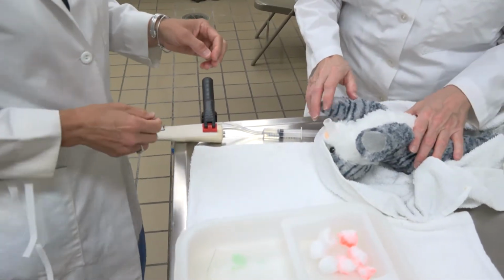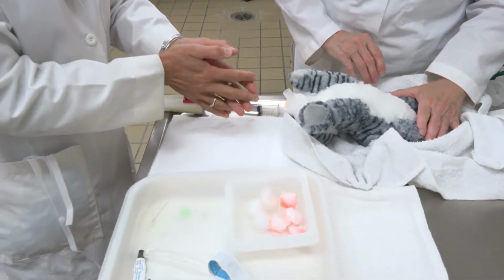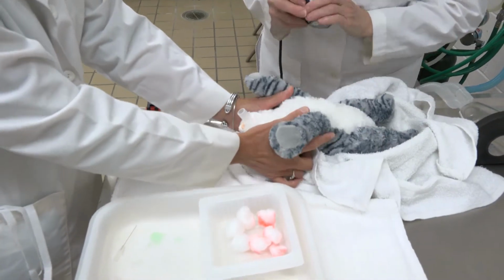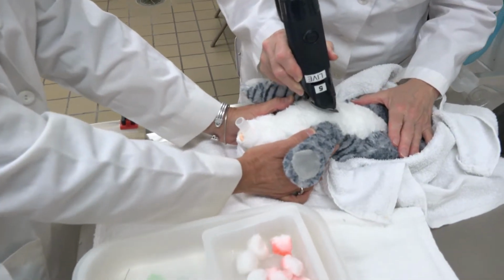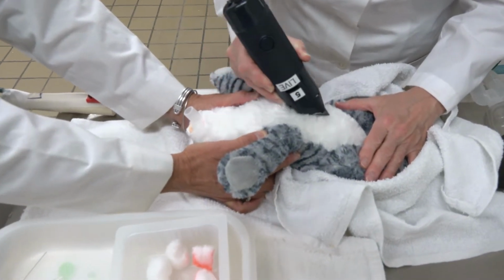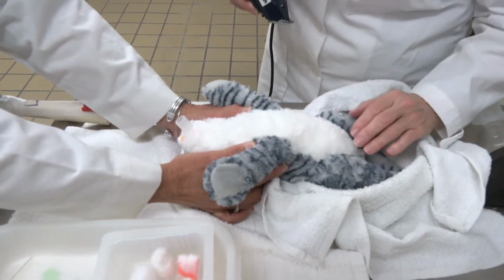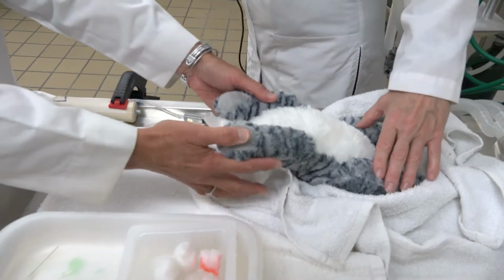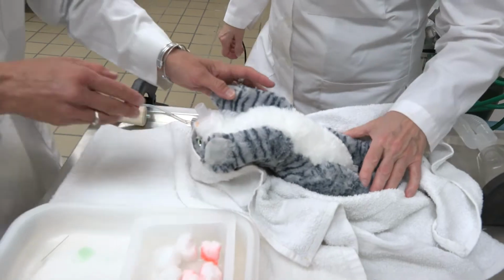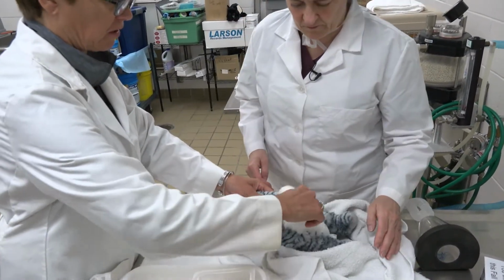You guys haven't done this before, so we'll learn that this fall. Pretend our animal's intubated, and now our surgeon's going to shave while I restrain for the procedure. So we're going to go from xiphoid to the pubis, and about a half clipper's width on each side of the teats. So by the magic of TV, that's shaved. Excellent. And let's move our patient into the surgery prep area, and we'll take the roller and just get off any residual hair.